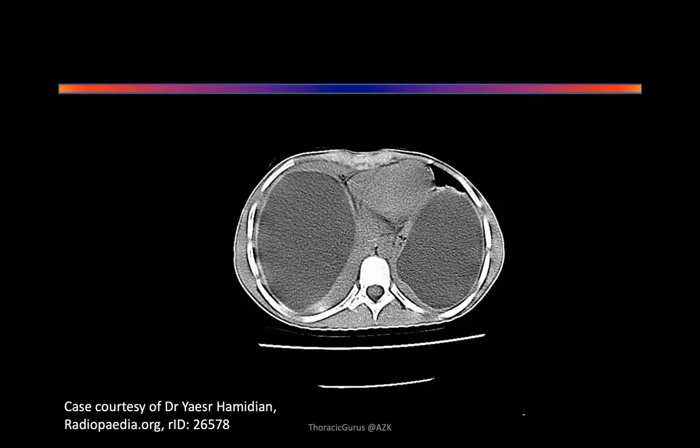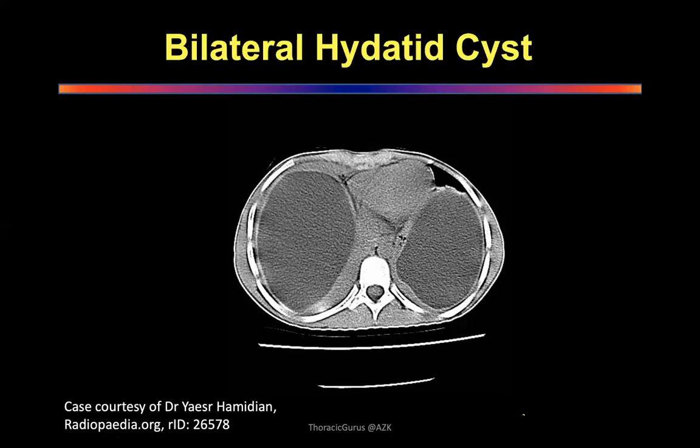It is possible. The one cyst that happens bilaterally is actually hydatid cyst. So bronchogenic is not common bilaterally, whereas hydatid is common bilaterally. So you should talk about common things as common. Though the features are not very classical of hydatid cyst, because you have just seen one shot and haven't seen the whole thing, with bilateral cysts usually you should think about hydatid cyst. Simple. Well done.